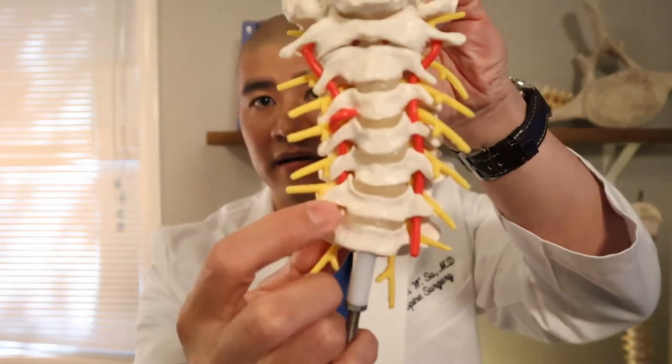Many patients get scared because we're going from the front of the neck — that must be dangerous. In fact, an anterior cervical approach is one of the most bloodless and benign approaches that we have. If you look up and push in the soft spot between the sternocleidomastoid muscle and the esophagus and trachea, you'll feel something hard — you're actually feeling the front of the spine, the carotid tubercle. From the skin incision to identifying the level of surgery takes only about three to five minutes. There are structures in the way, including the esophagus, trachea, and blood vessels, but the chance of injury to those structures is less than one percent.